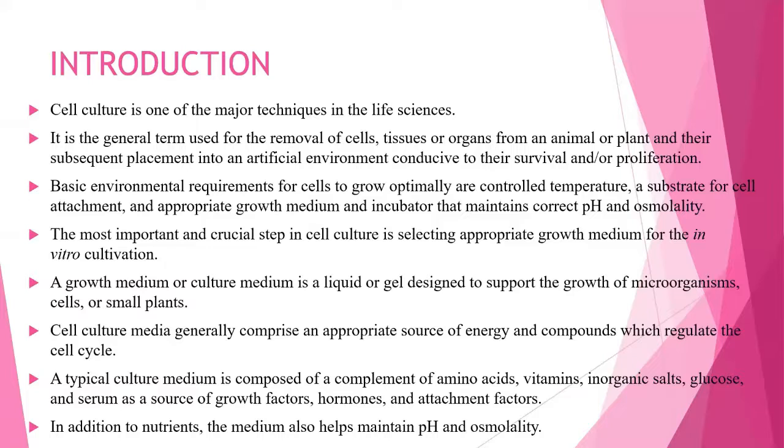Like how you sterilize all your glassware before culturing microorganisms in the lab, in a similar way we have to sterilize all the equipment that we are using for our culture purpose. Because cell culture is a very tedious experiment. It looks very simple, but once a small contamination occurs, the entire thing collapses.